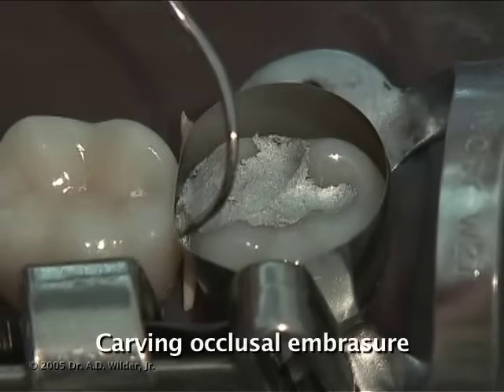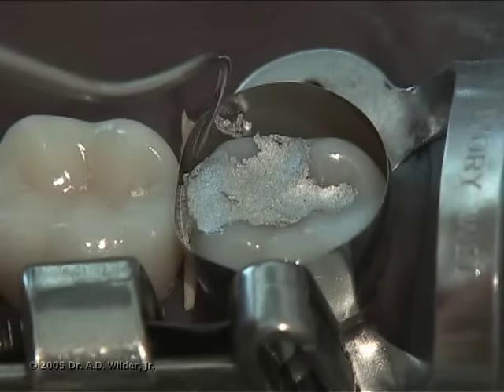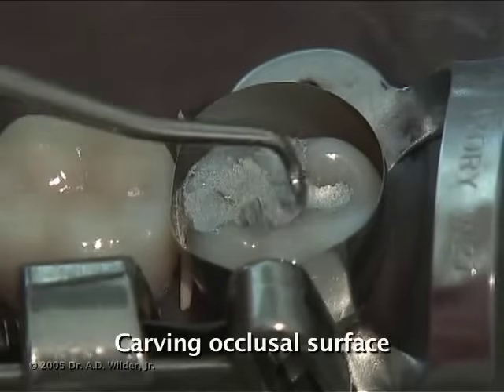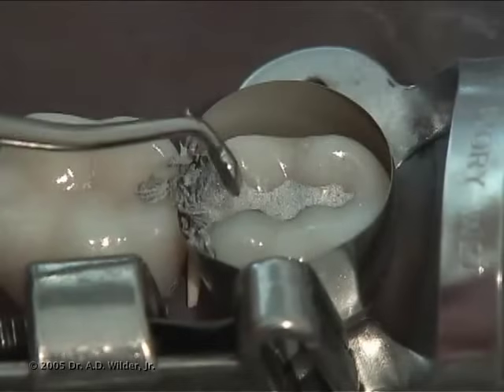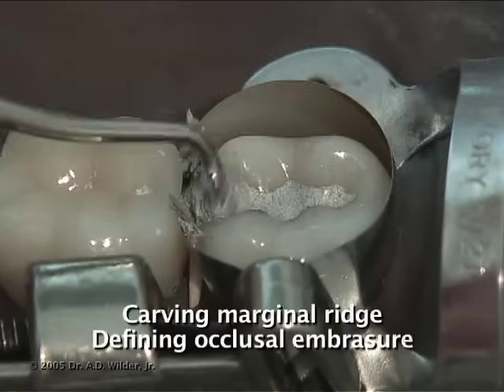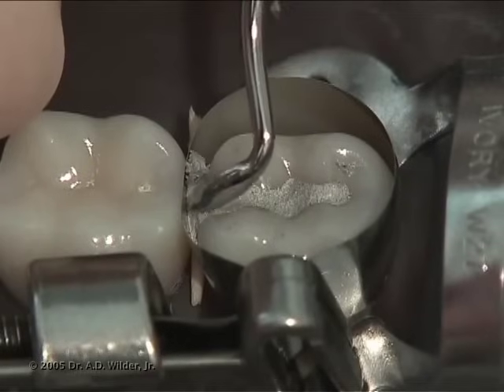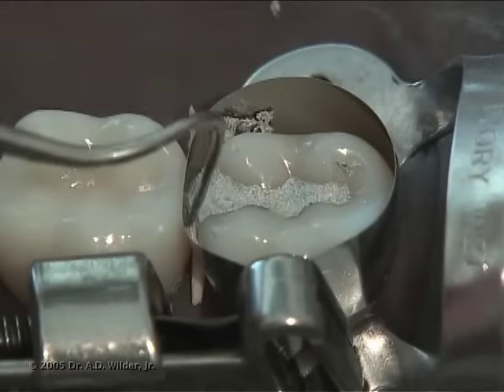Use an explorer on an angle with the tip resting against the matrix band to start carving the occlusal embrasure while the amalgam is still pliable. With a cleoid discoid instrument, you can carve the anatomy of the grooves and fossa. Always make sure that part of the instrument is on the tooth surface and part is on the amalgam. Always move the working end of the instrument parallel to the cavo surface margin. You can also use the cleoid end to carve the marginal ridge area and define the occlusal embrasure. The carving process should take place while the amalgam is setting.